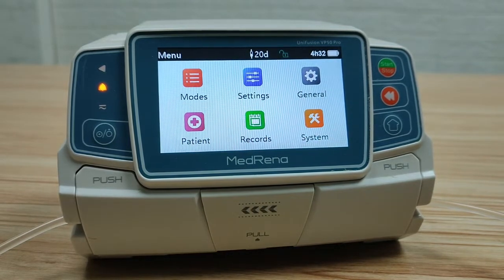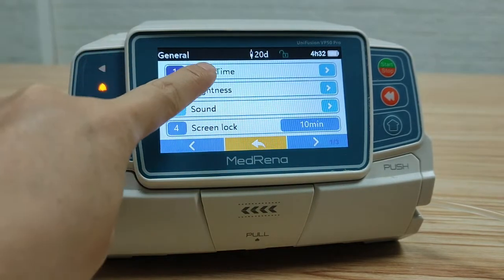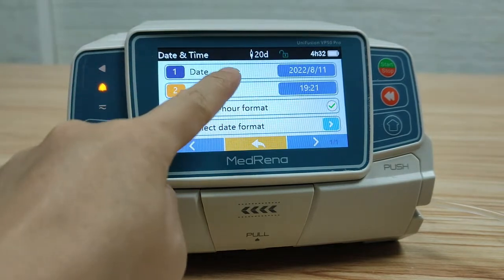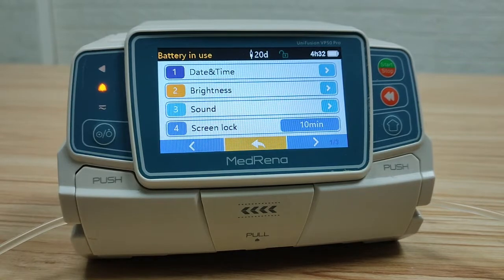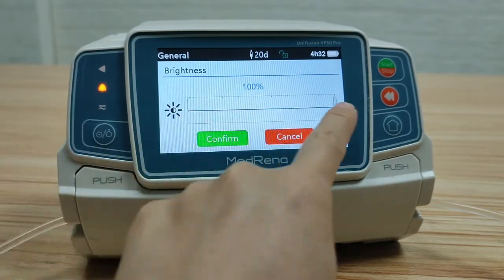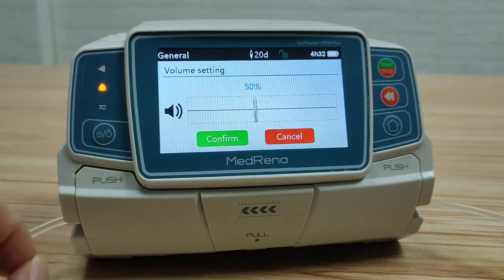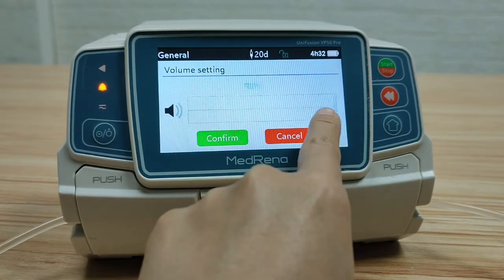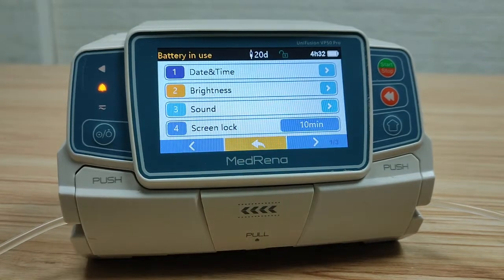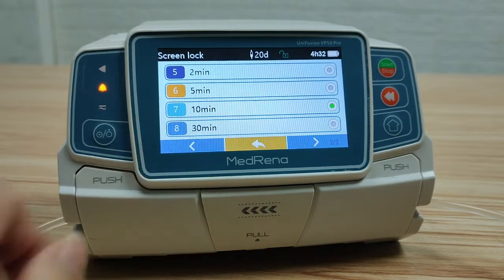Now we finish the introduction of settings; let's take a look at general. The first item is date and time — set the correct date and time and your preferred format here. Second, brightness — there are 10 brightness levels for choosing. Third, sound — there are also 10 levels of sound volume for choosing. Fourth, screen lock — choose how long you would like to lock the screen, from 15 seconds to 30 minutes.